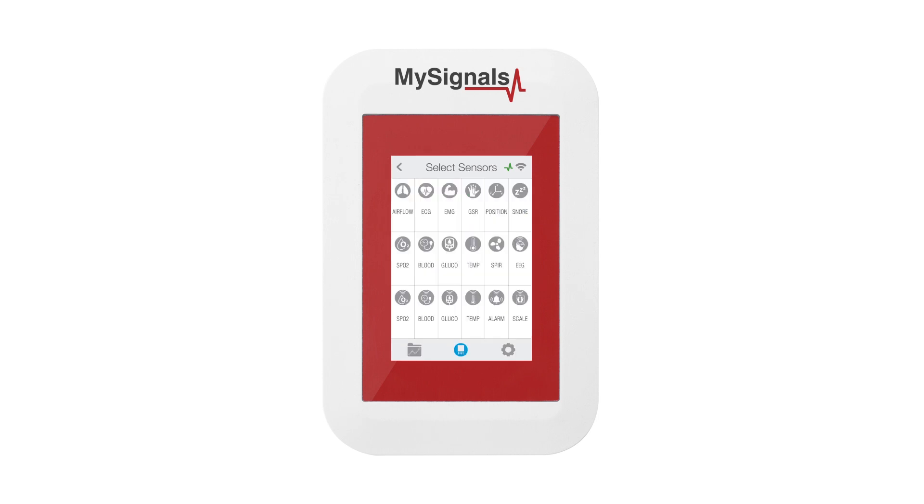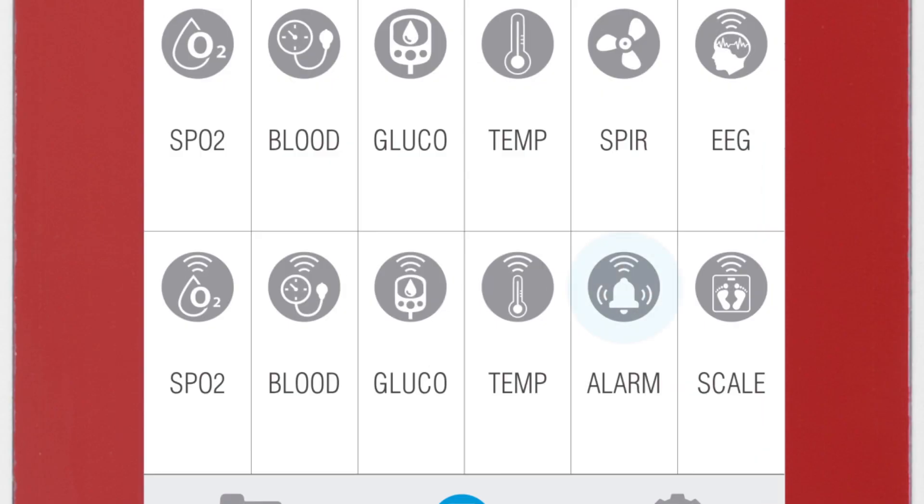In the Sensor Selection screen, you can see all the sensors available. By selecting the Alarm Button Bluetooth Low Energy Sensor, the icon will turn blue.